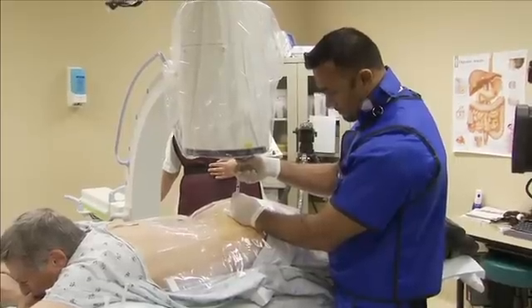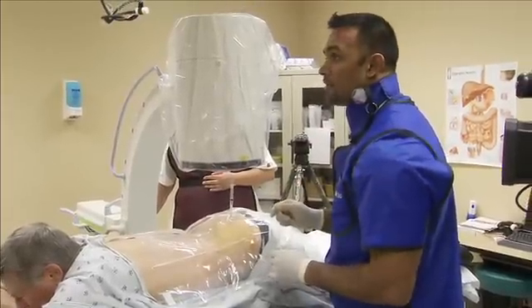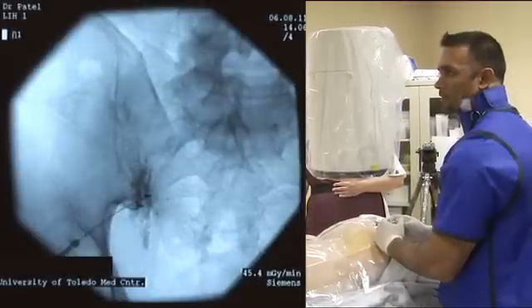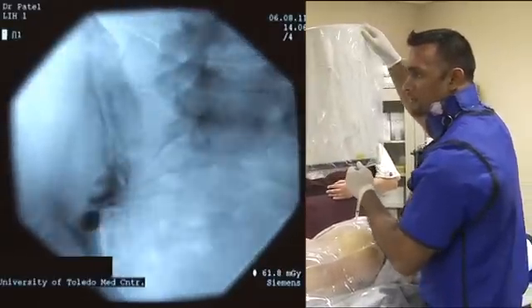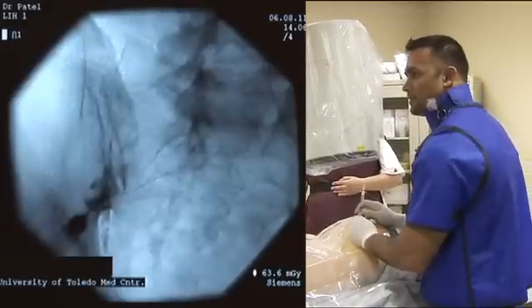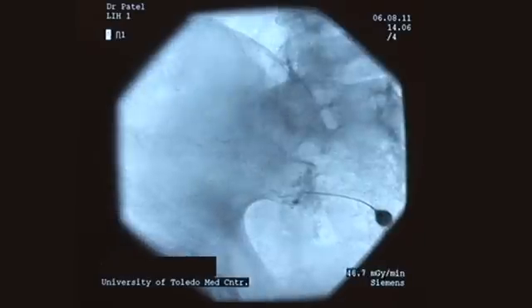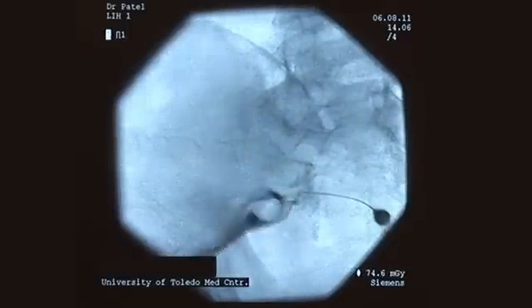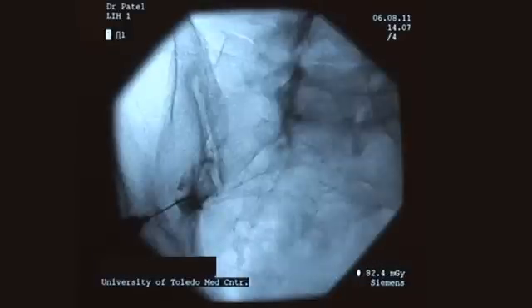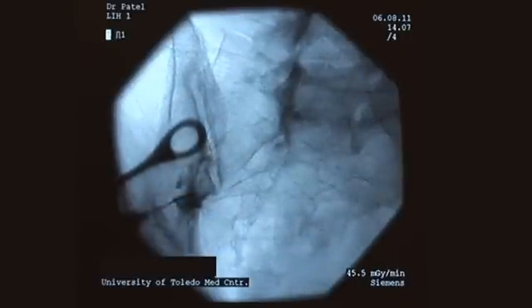Once the needle is properly positioned within the inferior portion of the joint, 0.25 milliliters of contrast medium of choice is injected. We can start seeing the contrast flowing up into the joint and filling up into the capsule. You can see all the contrast filling up the posterior part of the joint, and this is the anterior part of the joint. In the lateral view, you can actually see the contrast flowing up into the joint space.